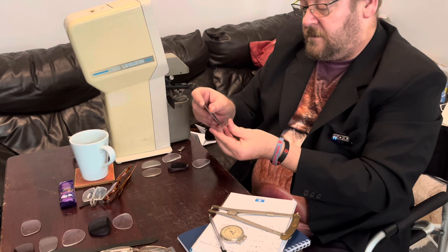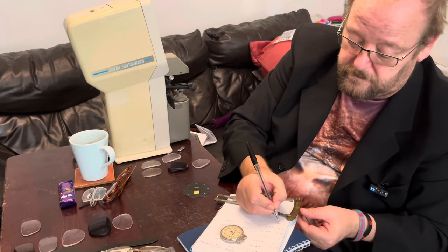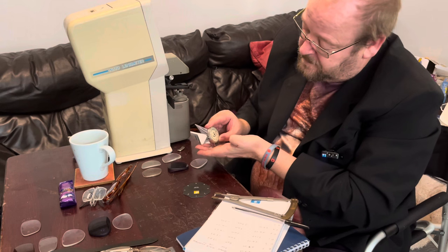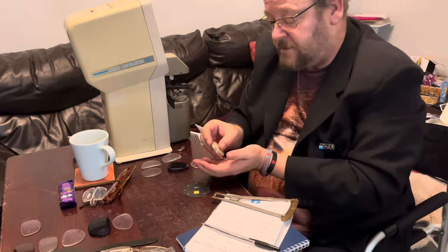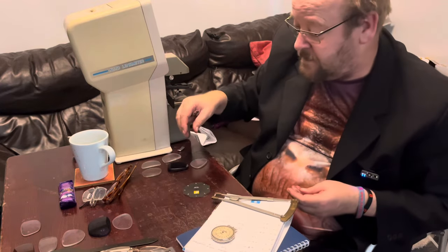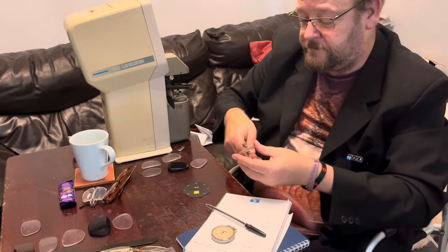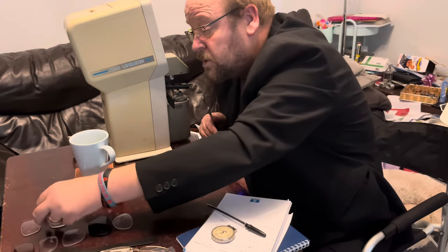So I'll just have the front curve on this one — it's three. Now I'm measuring the front surface prescription, which reads minus 7.50, so plus 7.50. Now I'll do the back surface. And now for the center thickness of the lens — 2.7 millimeters.